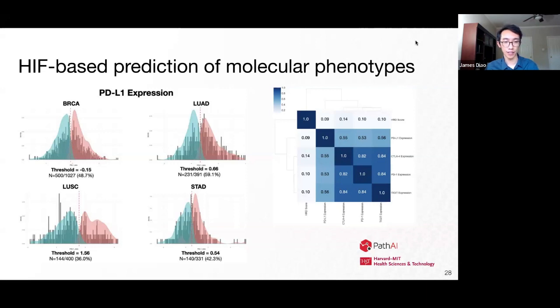And we didn't want to cut at the 50% threshold because the clinically meaningful threshold might not be one that separates the population evenly. And so we ended up using this Gaussian mixture model analysis where we modeled it as 2 separate Gaussians, and then just wherever the density curves intersected is where we drew the split.